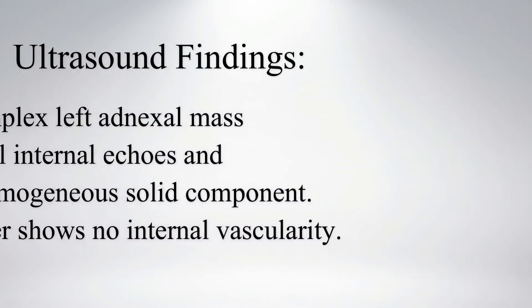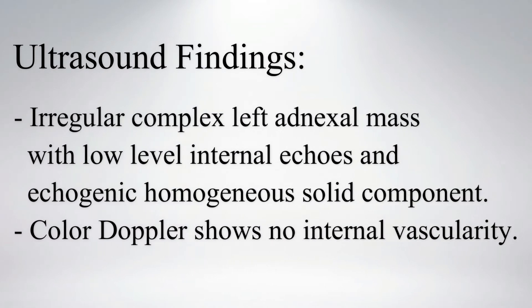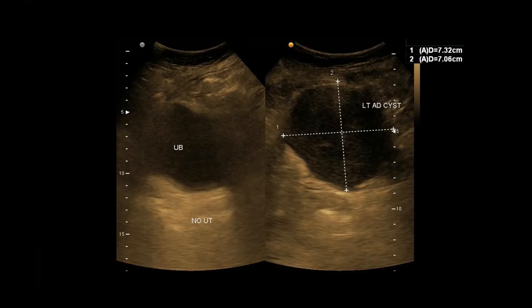On ultrasound, an irregular complex left adnexal mass with low-level internal echoes and echogenic homogenous solid component is noted. Color Doppler shows no detectable internal vascularity. The left image shows no uterus posterior to the urinary bladder.